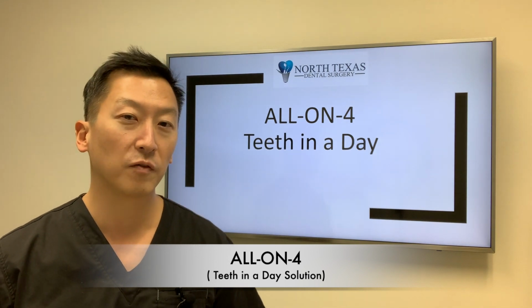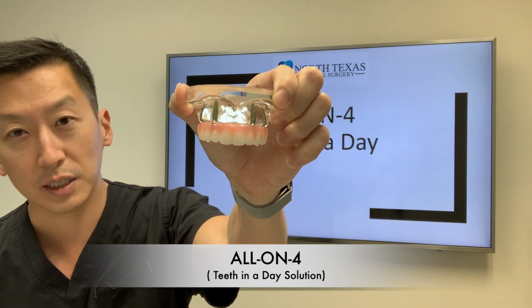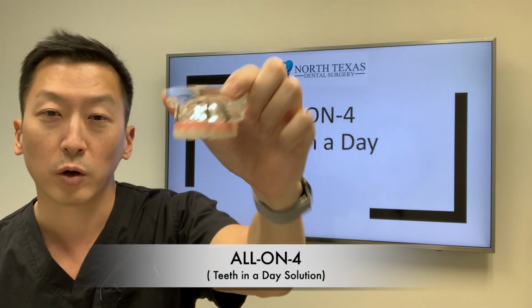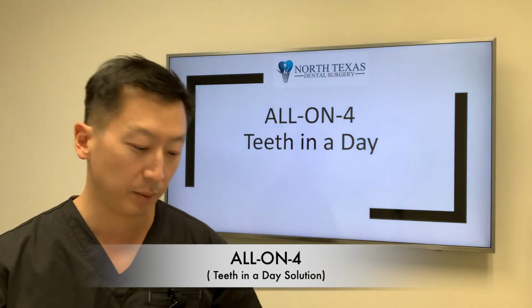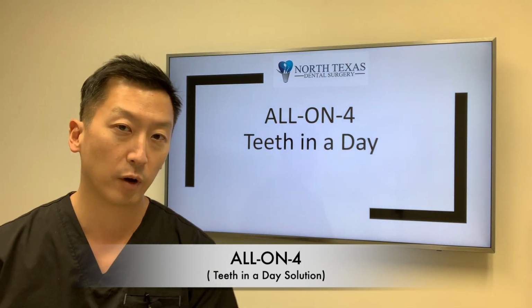So what the all-on-4 solution is, is a prosthesis that's actually fixated in your jaws and delivered to you the same day as your original surgery, where we're taking your teeth out or replacing your existing denture. But in order to understand some of the advantages of the all-on-4 solution, I want to take a step back and give you an overview of your other options.